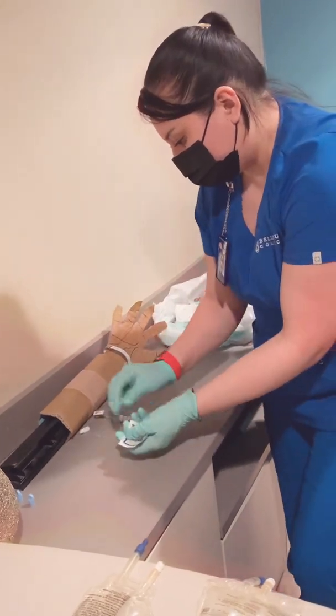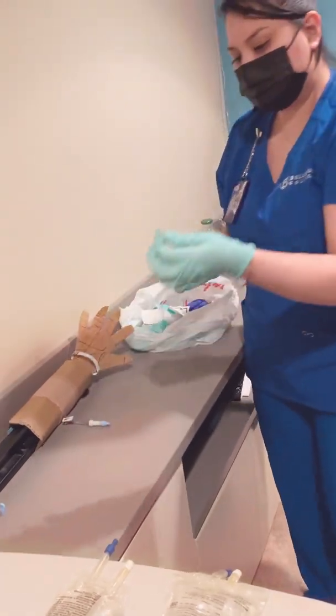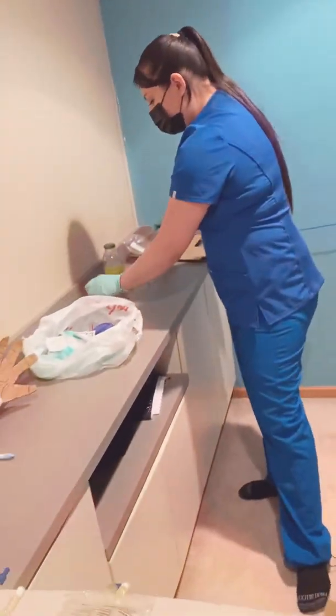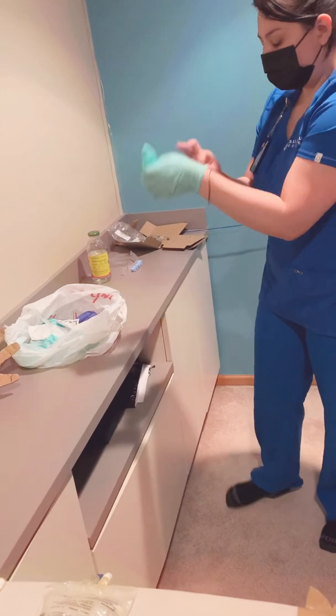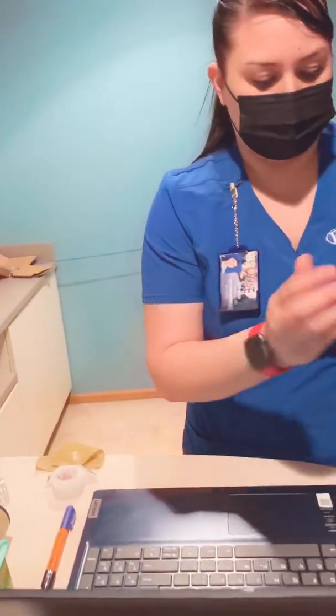And I'm going to collect all of my trash. And I'm going to dispense my needle in the sharps container. I'm going to remove my gloves. I'm going to then wash my hands.